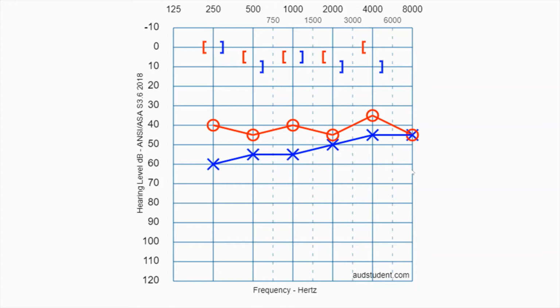That finishes our questions, so let's reshape what we just found out into what we need to know for audiograms, which again is laterality, symmetry, degree, configuration, and type. Our first question answered laterality and symmetry for us. Since the hearing loss is present in both ears, it's a bilateral loss.